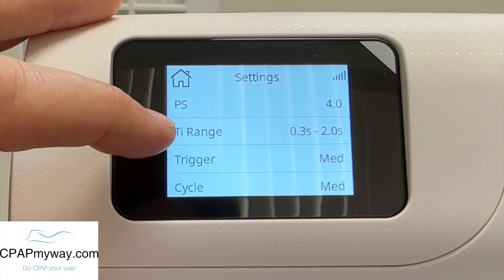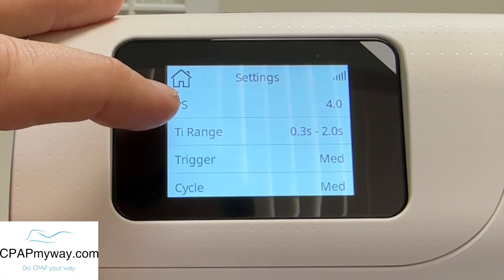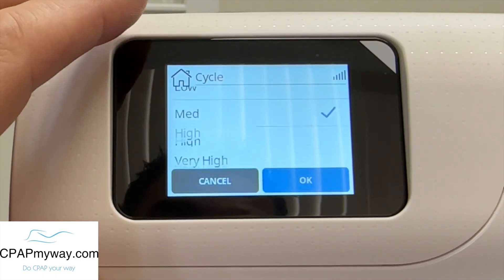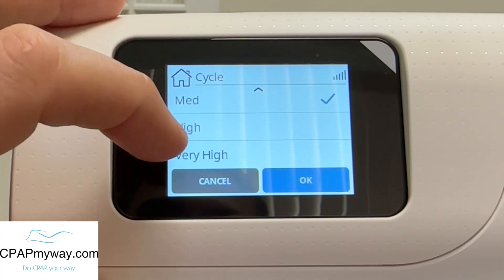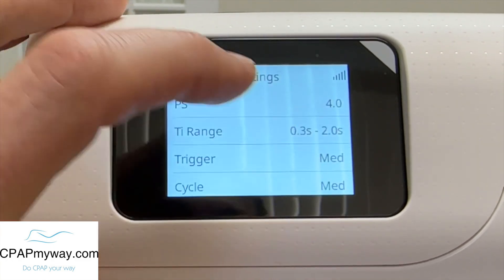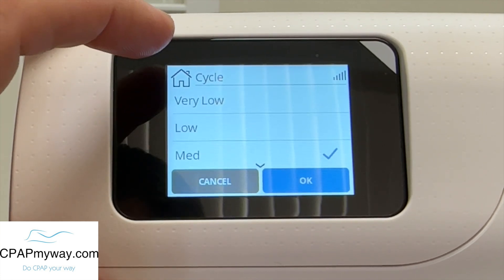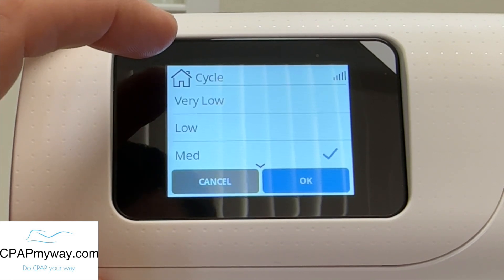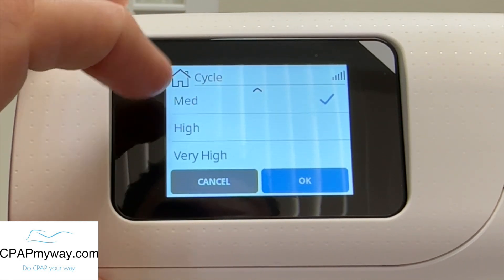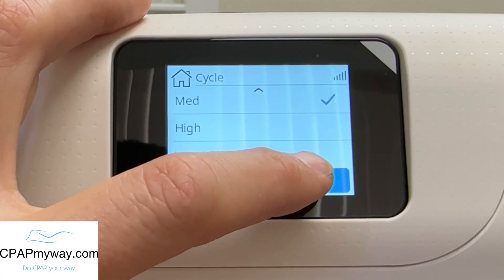Next on the menu is the trigger. Trigger is the sensitivity setting that tells the device to switch from your exhalation pressure to inhalation pressure. It's adjustable from very low all the way up to very high — very low would be low sensitivity, very high would be high sensitivity. It seems like most people do just fine on the medium; I haven't really seen many cases where anybody's ordered us to change that. Next on the menu is cycle — cycle is the opposite of trigger. That's the sensitivity that tells the device to switch from IPAP to EPAP for exhalation. That setting is additionally adjustable from very low to very high, low being the least sensitive, very high being very sensitive and quick to switch the pressure setting.